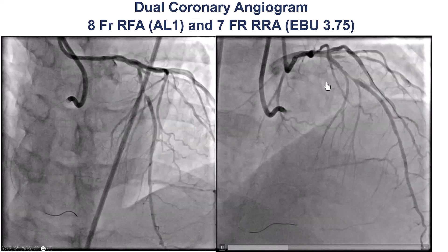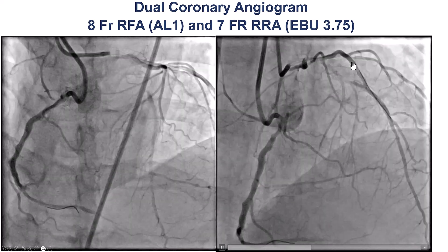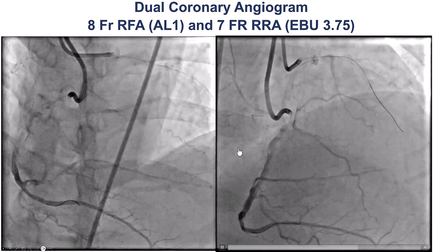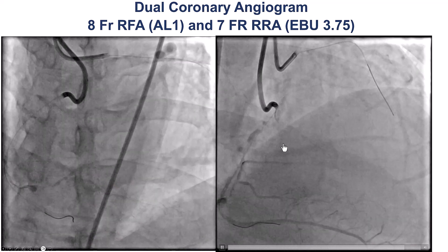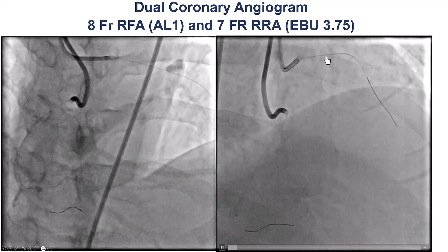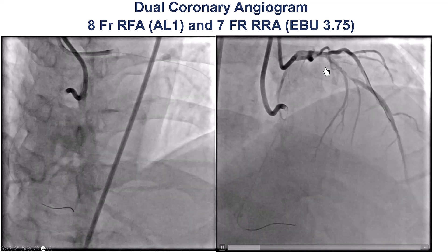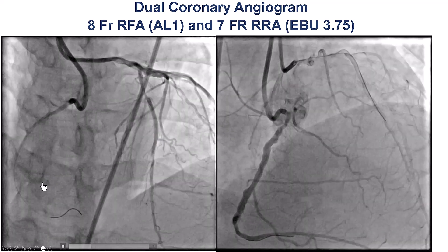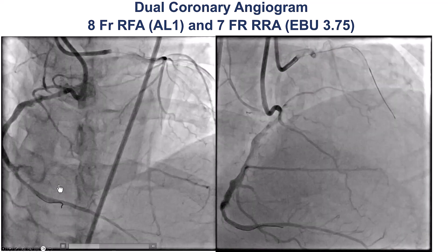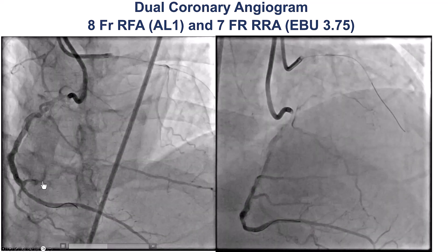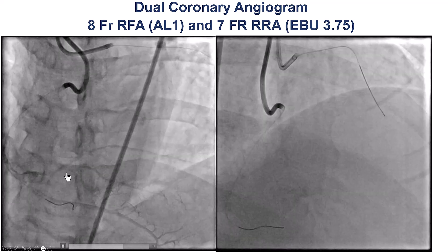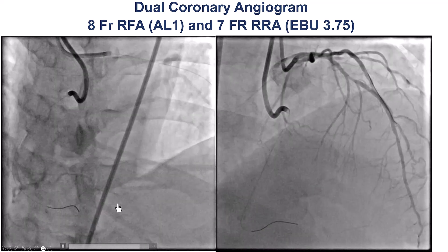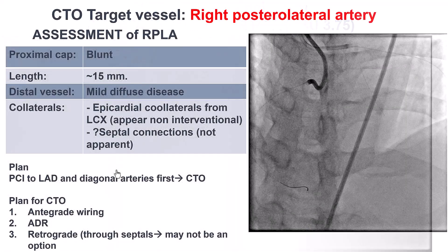This is his angiogram. He has a severe lesion in the first diagonal branch. There is also a significant lesion in the LAD and a CTO of the right posterior lateral, which is a fairly sizable vessel.